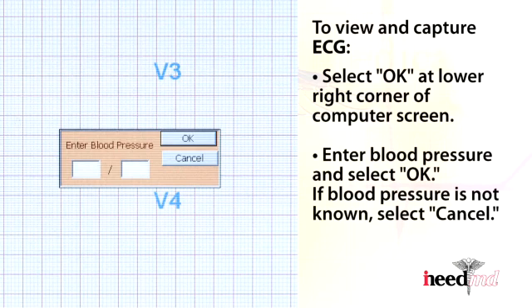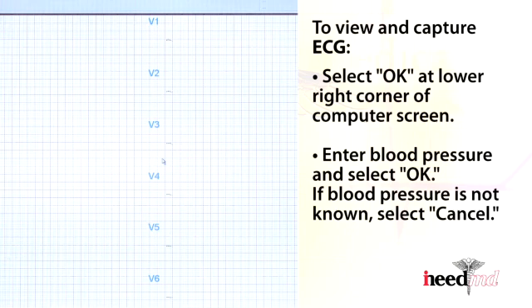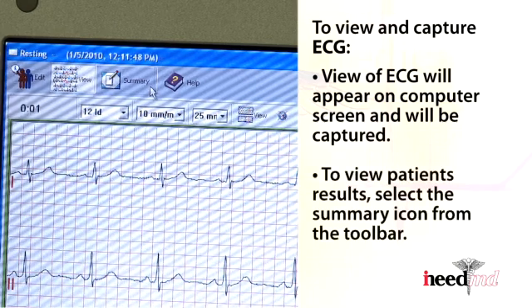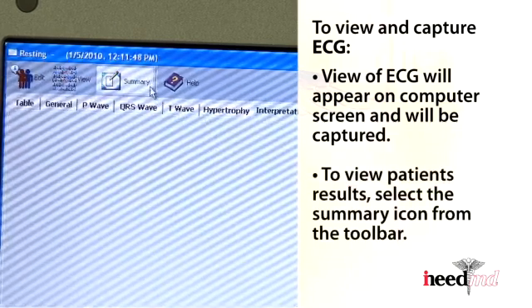Enter blood pressure and select OK. If blood pressure is not known, select Cancel. The view of the ECG will appear on the computer screen and will be captured. To view the patient's results, select the summary icon from the toolbar above.